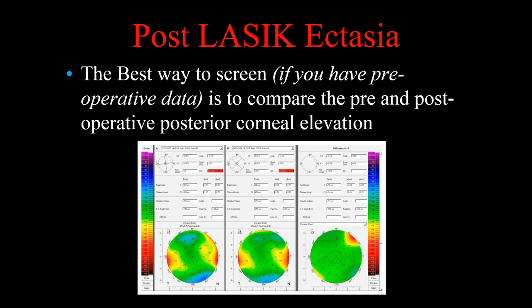I don't use it in that fashion, as I said, because the formulas, again, compensate, at least they try to compensate. And my biggest concern is avoiding an overcorrection. So most of the time, if the two match, it doesn't really matter what you use. As I said, if the total corneal is less, and within a half diopter, I'll use the anterior value.